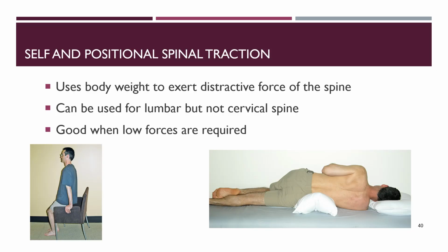And then here are some other home techniques, or positional techniques, that will be really beneficial for your patients. So you can see here, performing a little bit of distraction. It'd be better if the feet were dangling here so that it's getting a pull this direction and a pull this direction. But nonetheless, that'll work. If we are trying to gap this left side, we would like to place a pillow underneath the right side here, basically putting this spine into a little bit of lateral flexion towards the right, and this will open up those intervertebral foramen spaces on this side here.